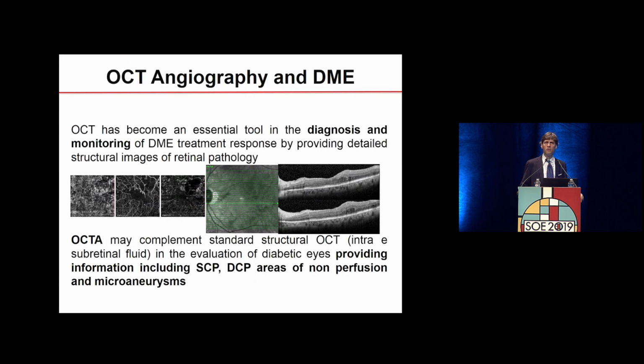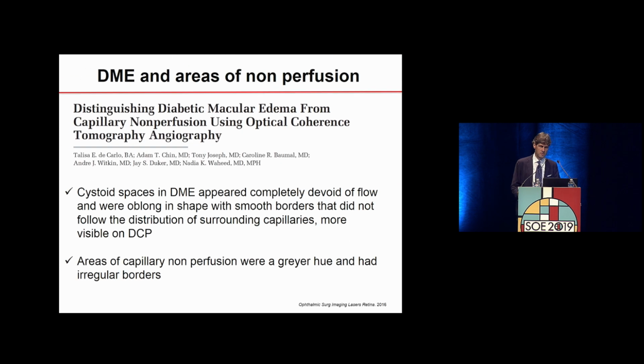Then we move to diabetic macular edema. And nowadays, we know how important is the application of OCT-A. And this is mainly because this is the first time that we can get a 3D or pseudo-3D visualization of different plexuses. And so we know that we can isolate and distinguish the superficial, the deep, and probably also an intermediate plexus. This is really the first time that we were able to do such kind of analysis. And starting from this, this group tried to differentiate between what is edema and what is non-perfusion.